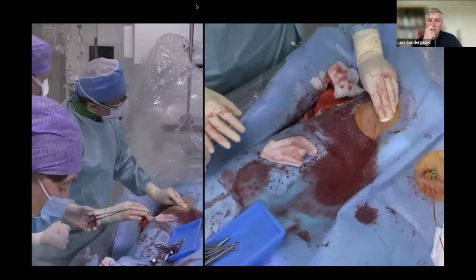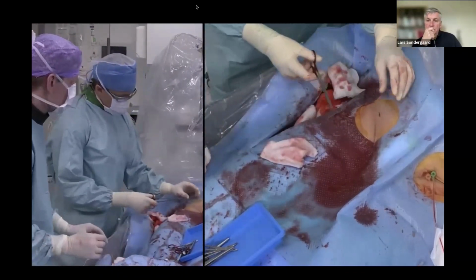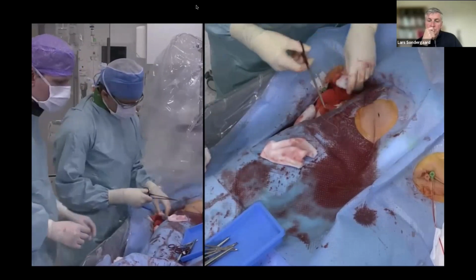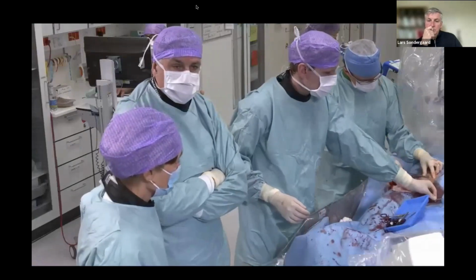As a routine, we take an ECG in here in the cath lab. We can see that the QRS duration is 150. So that's just on the borderline. So we don't expect this patient to have late high degree AV block. So the patient will leave the cath lab without any temporary pacemaker.